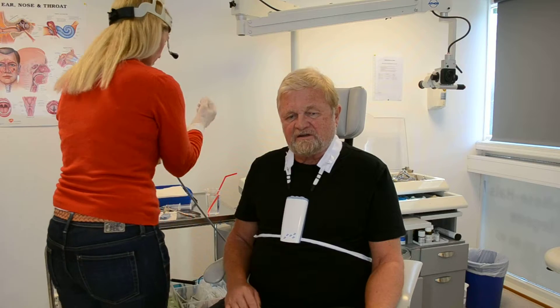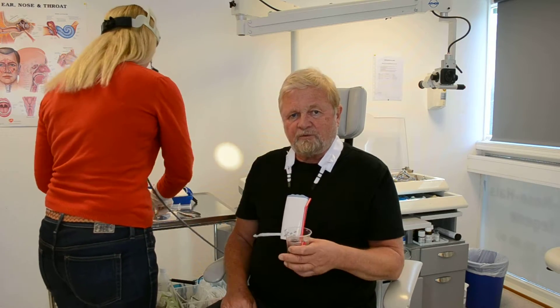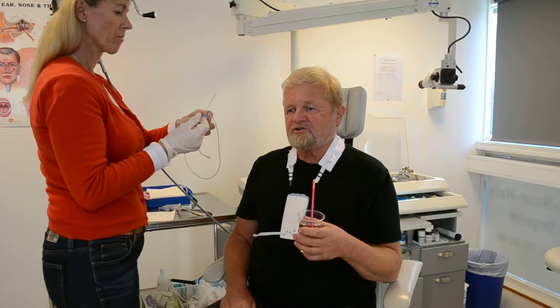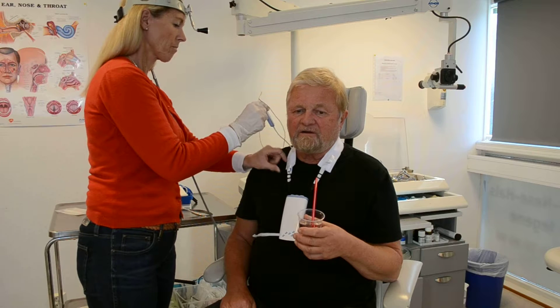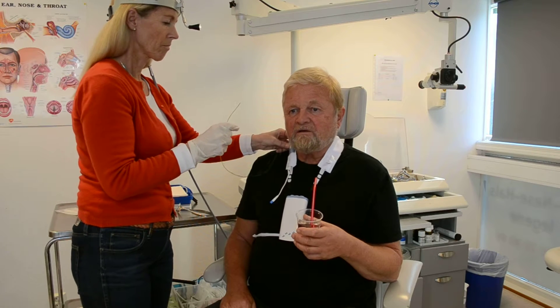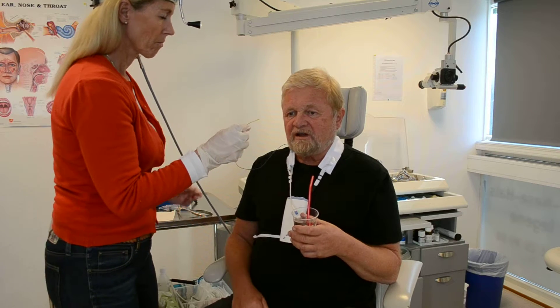When the local anesthesia has started to work, you get a glass of water with a straw and have it in the patient's hand. You then start insertion of the catheter, or the technical thread, along the floor of the nose, after having put the electronics in the pocket.